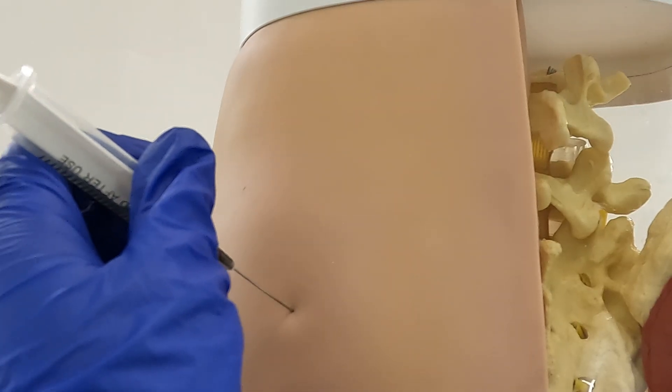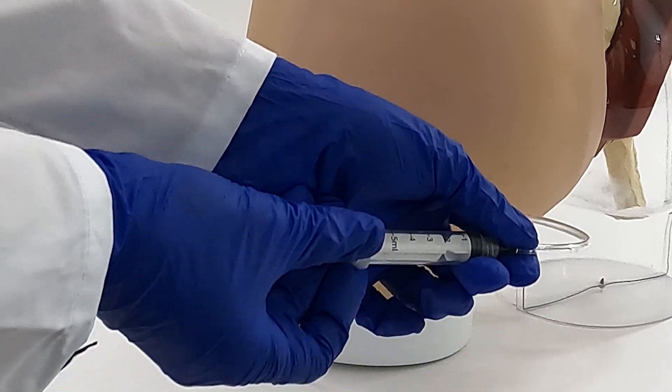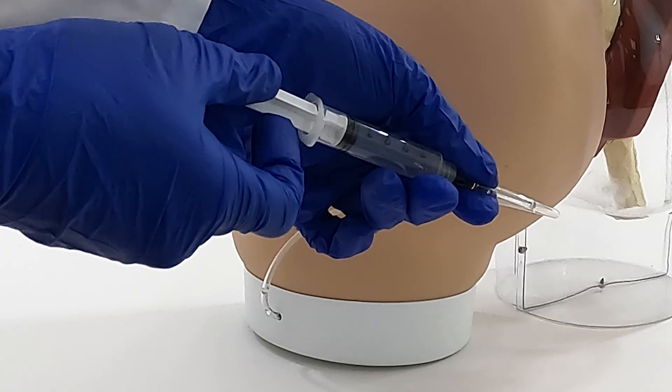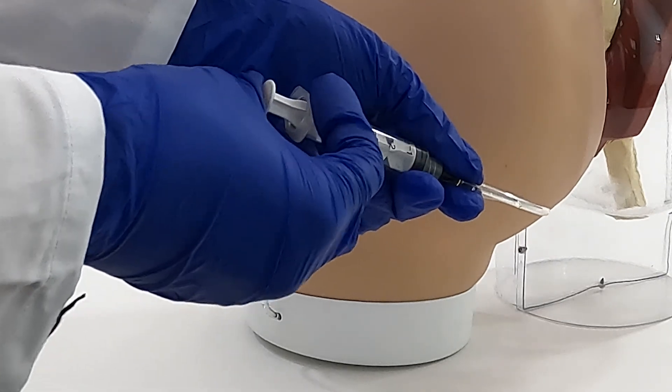Students can infuse real liquid during practice. The infused liquid collects in a small tank inside the model and can be drained through a tube after training, offering a realistic simulation.